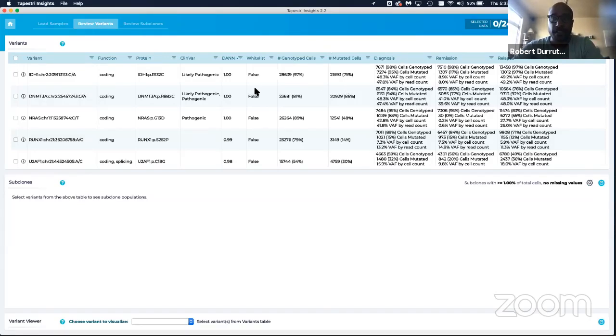And so this is really the mindset that you have to have going into this task: to identify the relevant variants for your downstream analysis. The three key categories of variants that are listed in this table are, first, germline mutations of high quality that will always be picked up by our panels. Secondly, your somatic mutations that are pathogenic and disease relevant. And then a third small category are potential false positive variants that may not have been filtered out automatically by the filters, and you have to identify manually.